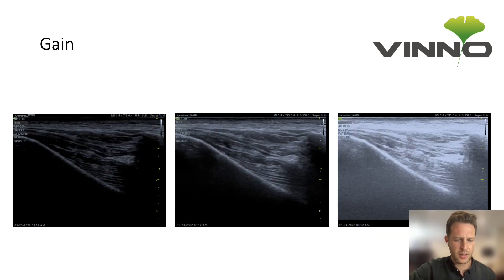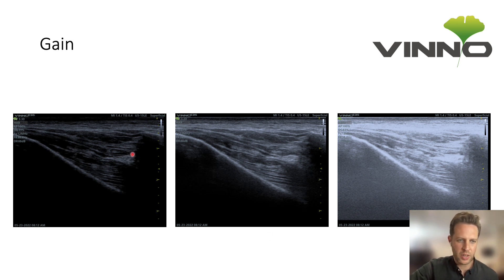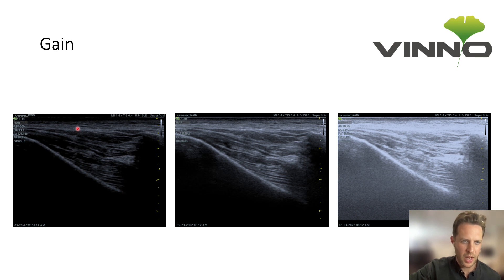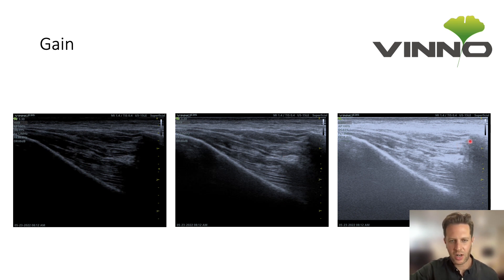The next thing to optimize is your gain. On the left side of the screen you can see what happens when gain is too low — you lose detail especially in the far field areas and it becomes difficult to differentiate layers. In the middle we have the optimum gain, where you can clearly see differences between each layer. On the right, turning gain up too much blurs the layers together and makes it difficult to differentiate parts of the image.